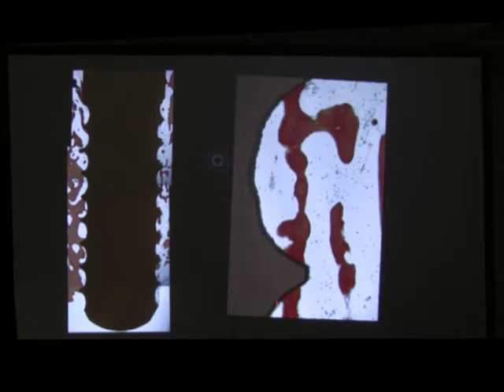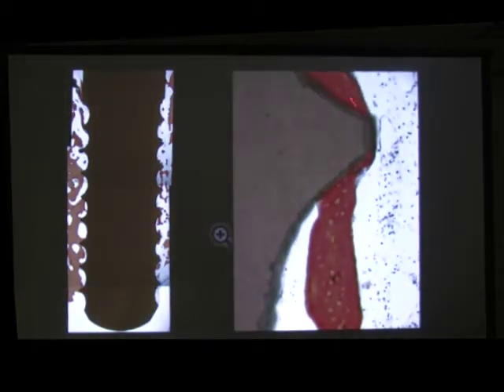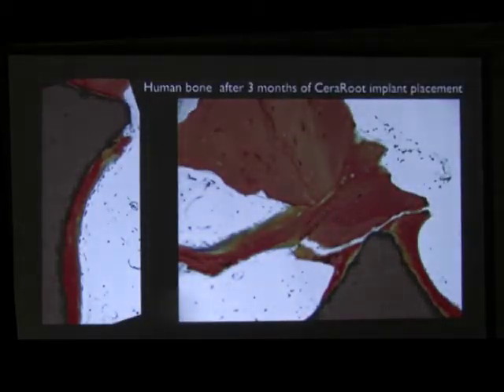And new bone formation in the threaded portion, so we can see that areas that will receive load in the future are starting to be in contact with new bone. Even though this implant has not been loaded, we can see that the bone apposition is being done in between threads also. So there is a very nice connection in between threads, and not just inside the thread, but also covering all the areas. We think that the thread formation, the shape of the thread, is not really important in terms of osseointegration. And this is new bone formation, and this is mature bone.